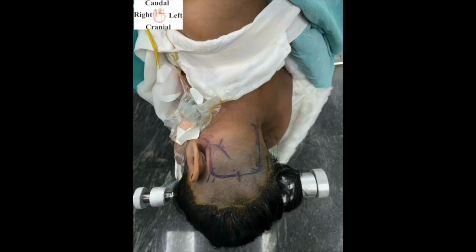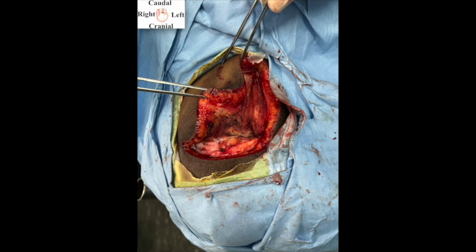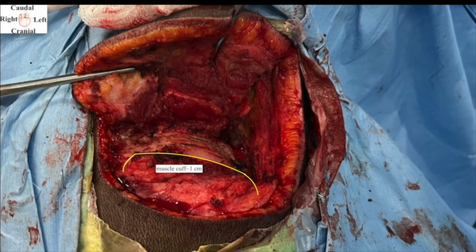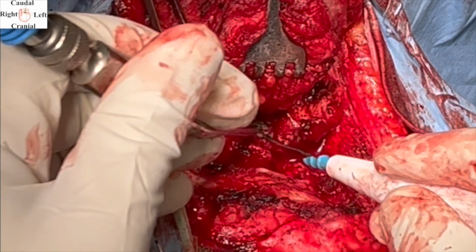A curvilinear hockey stick incision was marked, extending from just medial to the mastoid tip, curving caudally and medially towards the midline over C2 spinous process. The musculocutaneous flap was elevated in the midline avascular plane, starting from spinous process of C2 till the inion, curving laterally along the superior nuchal line, leaving a cuff of muscle, and then progressing inferiorly till the mastoid tip. The rim of foramen magnum was delineated and C1 arch was identified.